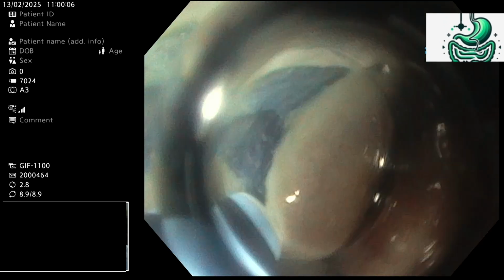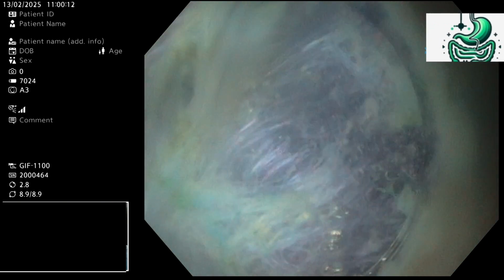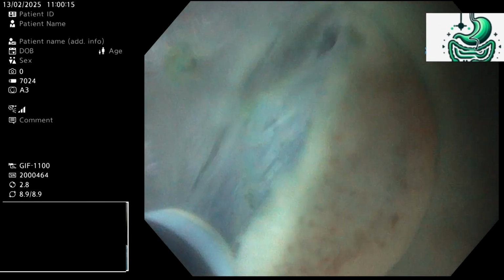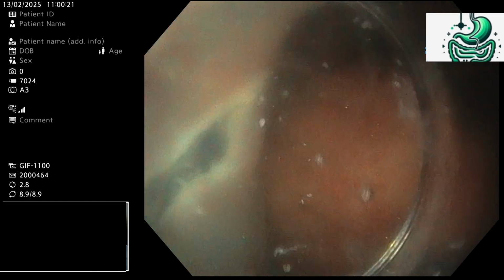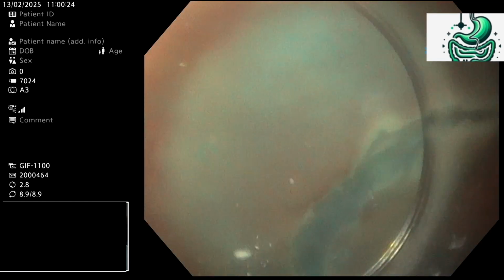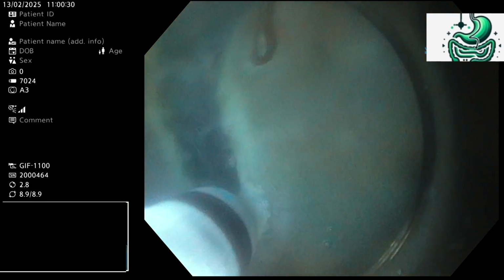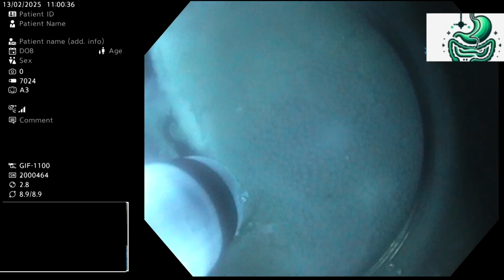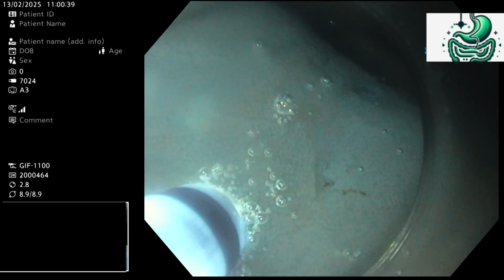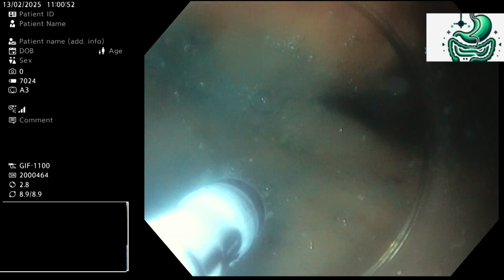Alberto, what are the advantages of the saline immersion irrigation technique? We have many advantages. In 1 minute I will be very brief. The main advantages compared to water, and this is why Ed and I are quite pedantic about saline, is that there is more conductivity, so the electricity travels better and you have a better, more precise incision. In addition, the vision is improved with saline and the buoyancy effect is improved, as I will show you in the lecture. We have to give the line to another room, but we will be back soon.